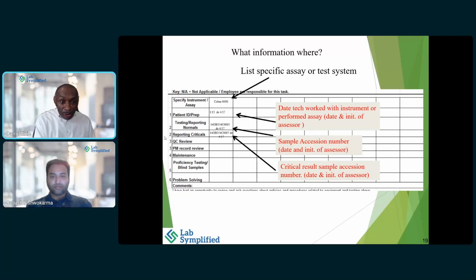Those are what you don't have to do a separate test system for, like a sodium each test. No, it's the same movement, especially those that are automated, because those are moderate complexity tests. You throw a tube on, there's no sample manipulation. Those are one test system.